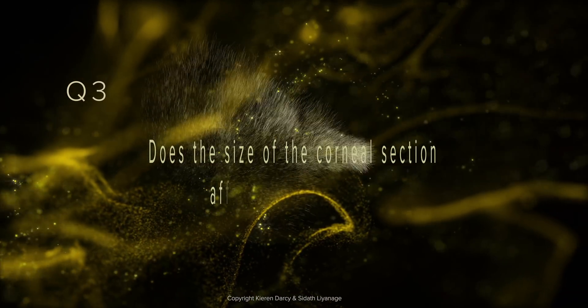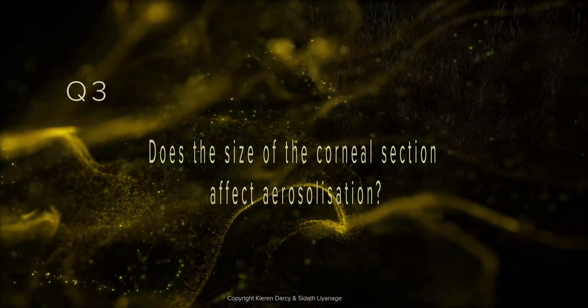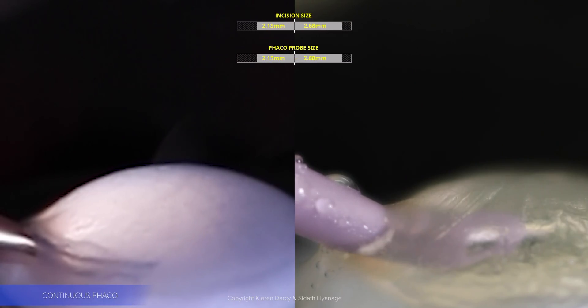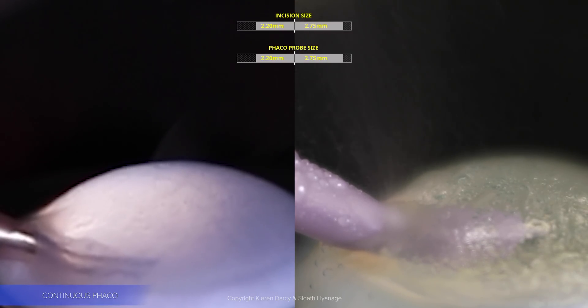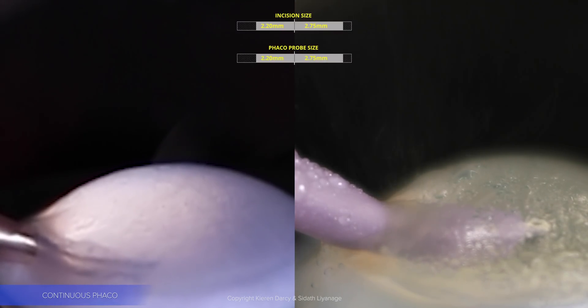Question 3: Does the size of the corneal section affect aerosolisation? The left, a 2.2mm incision. The right, 2.75mm. Both with corresponding phacoprobe sizes. With repeated testing, no aerosol is visible with a 2.2mm setup.